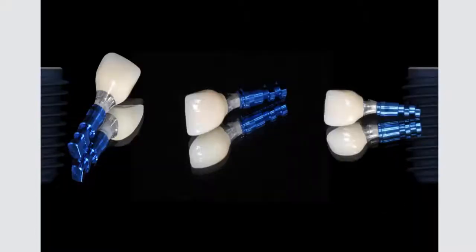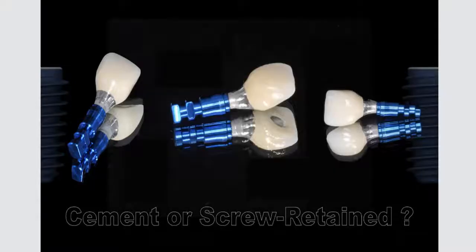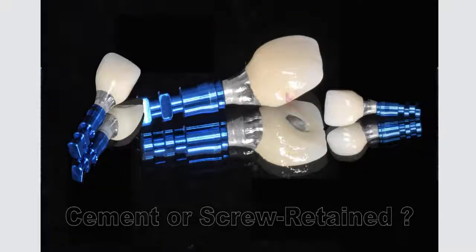And this is what we need to be able to appreciate, because when our laboratories help design the restorations, we want to be able to have a result that looks like a tooth sitting on its root. And here you see the beautiful emergence profile, but is this screw retained or is this a cement retained with a CAD/CAM restoration? We have to think about what is the outcome before we touch the scalpel to the patient. And as you can see, if we want to have a screw retained restoration, it'd be nice if that screw access hole came out right within the envelope of the tooth. So that is the goal.